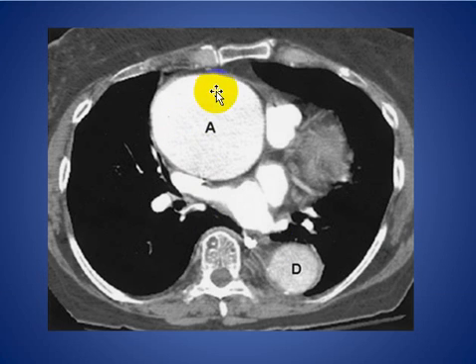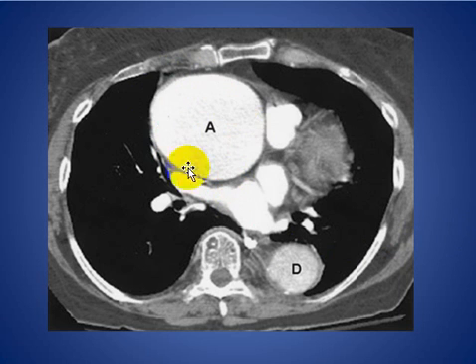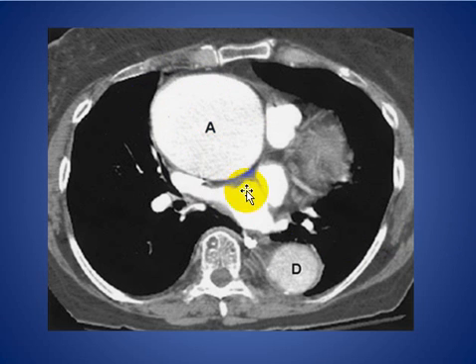Here you see a large mass in the anterior mediastinum. This is an aneurysm of the ascending aorta.